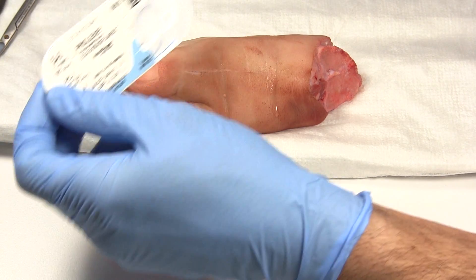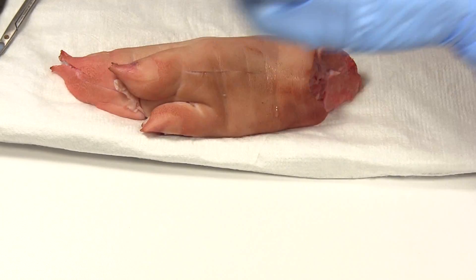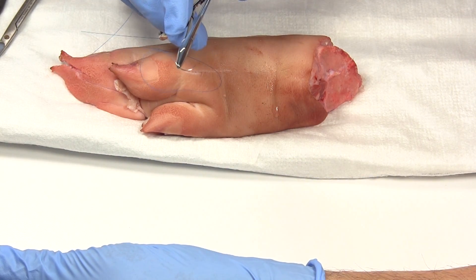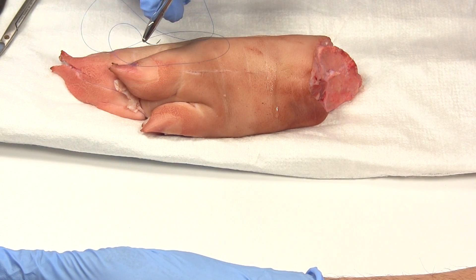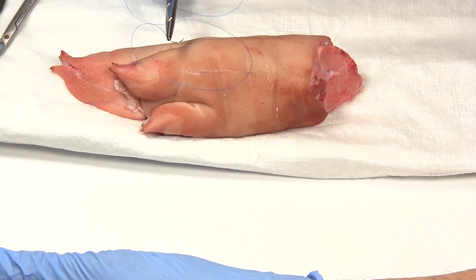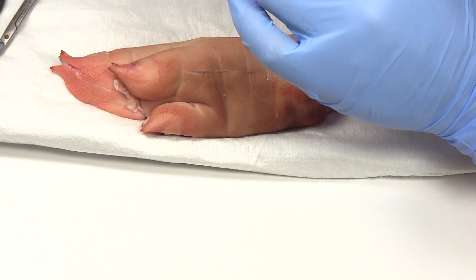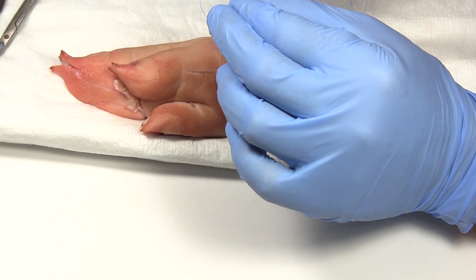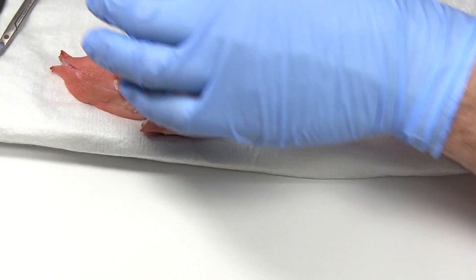Here's a tip about holding the needle. You can see I'm holding the needle pretty far back. If you hold a needle — especially a smaller needle like a 5-0 or 6-0 — that far back, the needle is going to bend. Once the needle bends, you're done for and there's no turning back — you just need to go get more thread. I learned that the hard way as a student. You want to grasp the needle about a third of the way down, and that gives you just enough to put it through without bending.